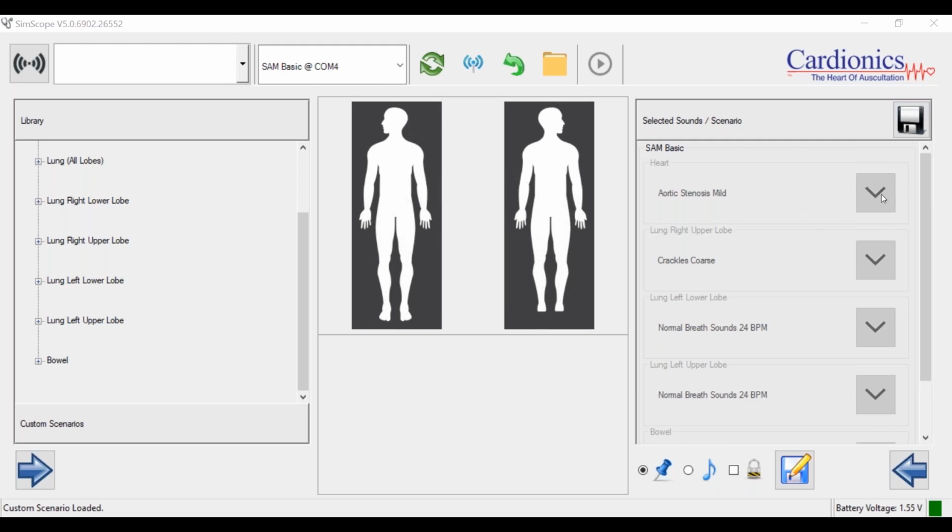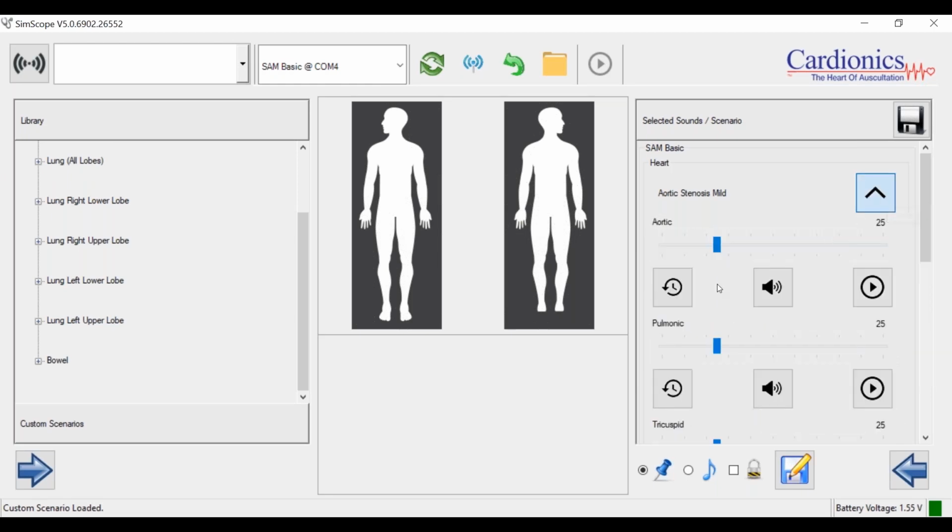So you always have a box here showing you the sounds. And if you click, for example, you can also interact with the sounds further when they're connected here. So I can store and mute. Maybe I need to do an explanation to the students as a teacher, or I need to explain something. Then I'll just unmute it, and then it will be played again. And here you have a play button.